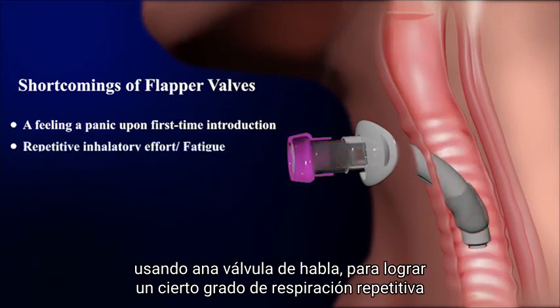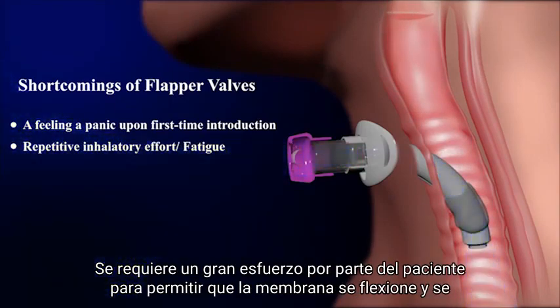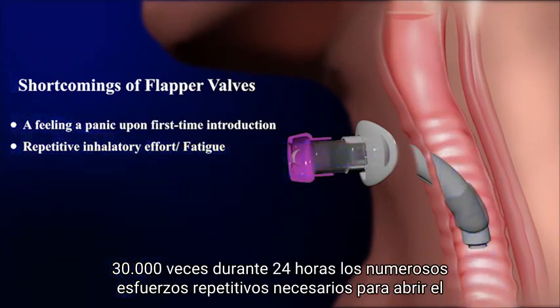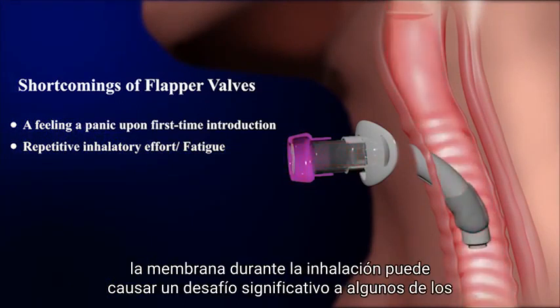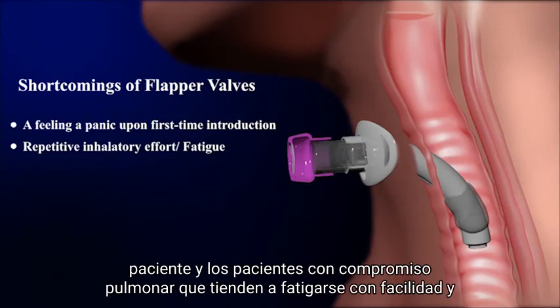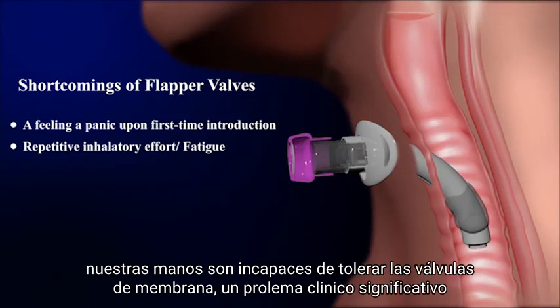A certain degree of repetitive breathing effort by the patient is required in order to allow the membrane to flex and open with each inhalation. Since the average person takes about 20,000 to 30,000 breaths per 24 hours, the numerous repetitive efforts required to open the membrane during inhalation can cause a significant challenge to some of the tracheotomized patients, especially the young children, the elderly patient, and the patients with pulmonary compromise who tend to fatigue easily and are hence unable to tolerate flapper valves.